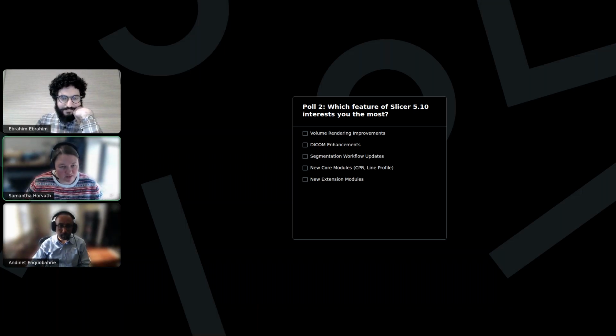So if you go ahead and give us some idea of what people are interested in and what they really want to hear about. Yeah, and just as a reminder, the choices are volume rendering improvements, DICOM enhancement, segmentation workflow updates, some of the new core modules we have, and then the new extension modules.